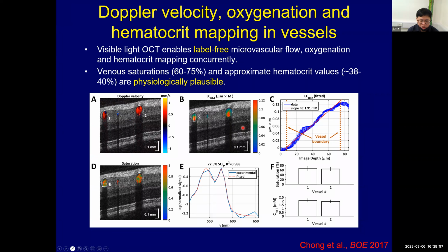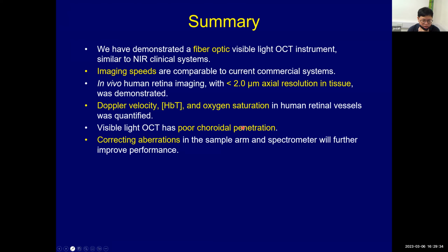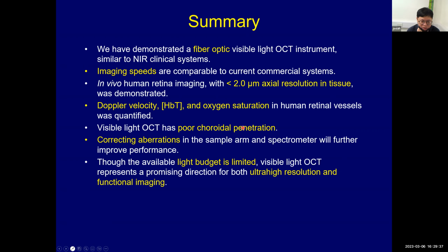There are a lot of studies that show that the metabolic state of the retina could be affected in some diseases, and there is a lot of effort trying to use this as a biomarker for diseases, because people believe that when the metabolism is affected, it may show up quicker than the structural damage, which is more like a stage when it is non-reversible. So yes, that is a very quick highlight of what I presented.